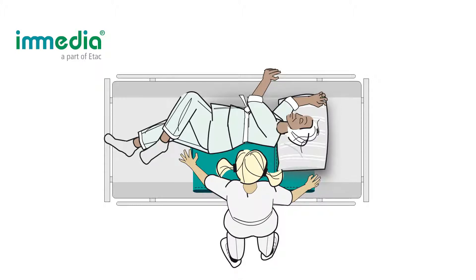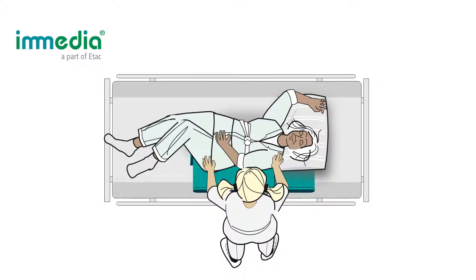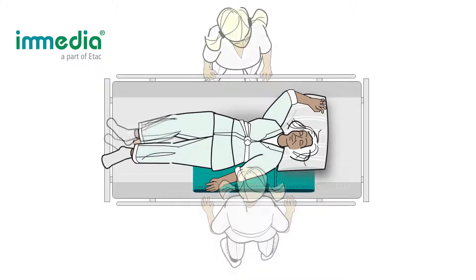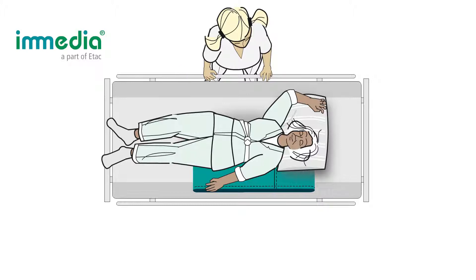Ask the user to roll back down and assist the user if needed. Put up the bed rail on your side before you change sides. Move to the opposite side of the bed and put down the bed gate on the other side.